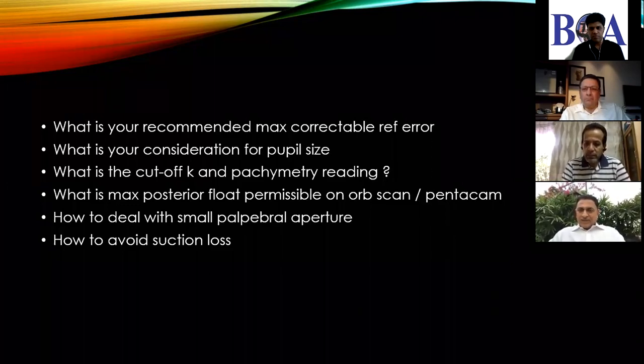Raja, what is your cutoff of pachymetry for LASIK or PRK, and do you use it to differentiate which procedure? See, pachymetry is relative to what correction I want to do and how much my laser ablates per diopter. And having done those calculations, I see whether the pachymetry in question is appropriate, and we've gone through that.